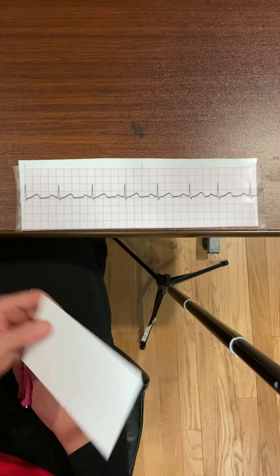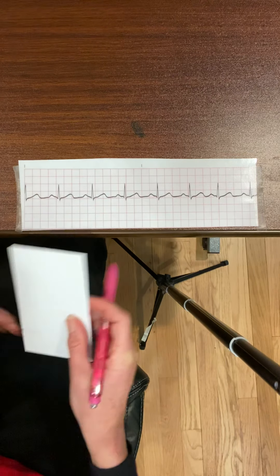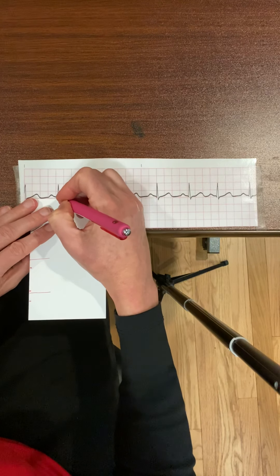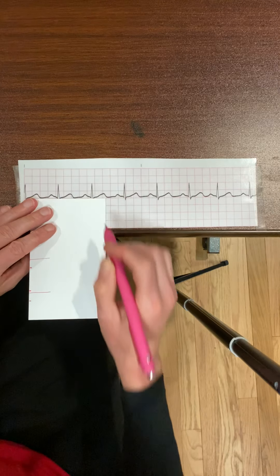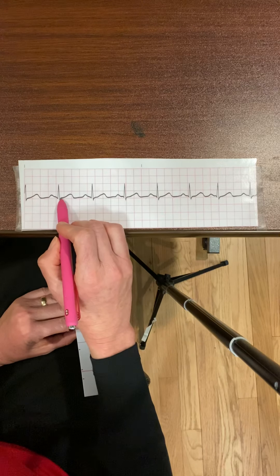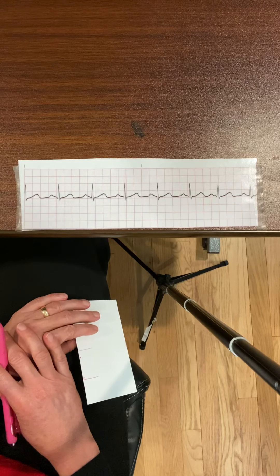The last thing I'm going to do is examine the ST segment. I want to know if it's isoelectric — meaning it's flat, not raised and not depressed. This ST segment is isoelectric; it is not elevated or depressed.